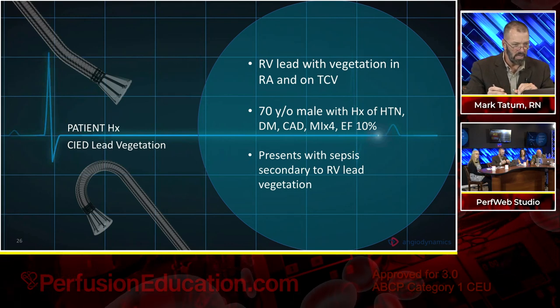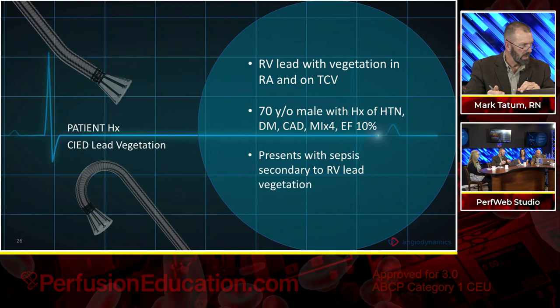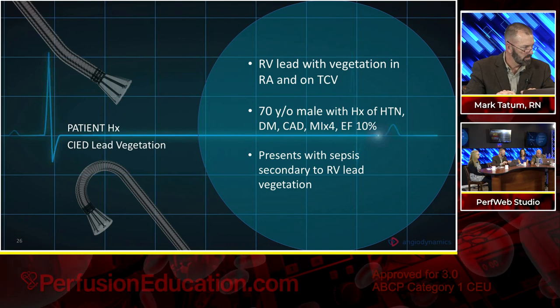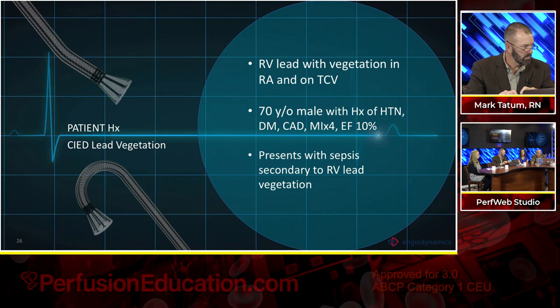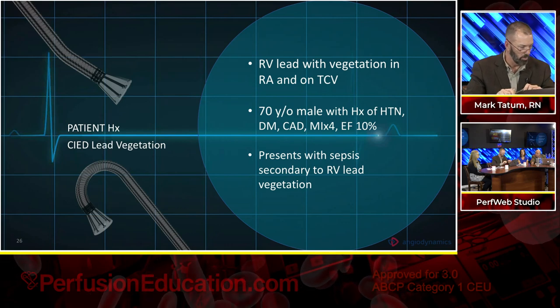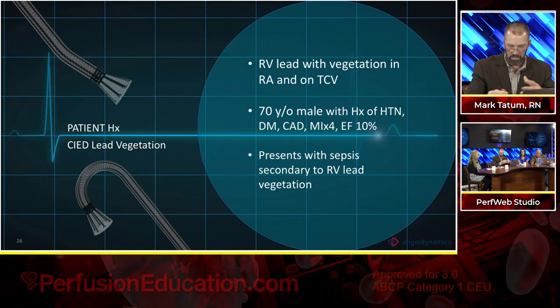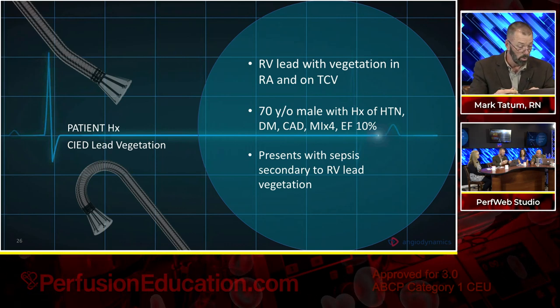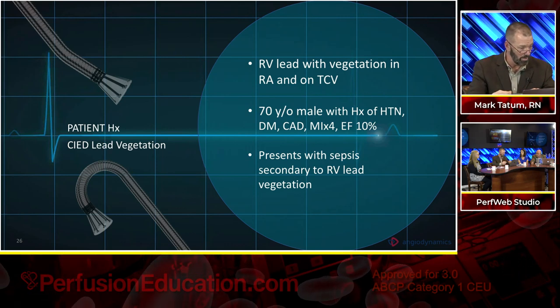Now, you will have some mild hemodilutional effect, but mild. Mild, yes. But you could also do a blood prime and fix that. So there are ways around it. And I'm glad that you brought up the mild hemodilution. The cannula and circuit, the entire thing primed, is roughly 600 to 650 cc's of saline, or your favorite non-dextrose-containing product.